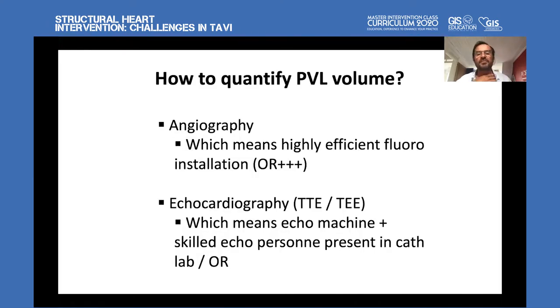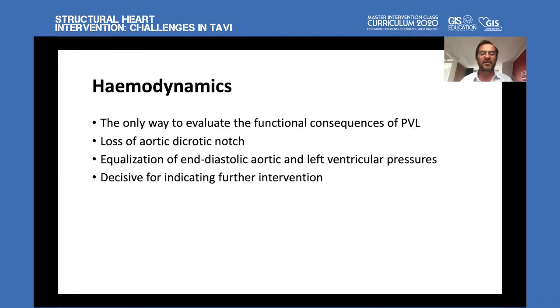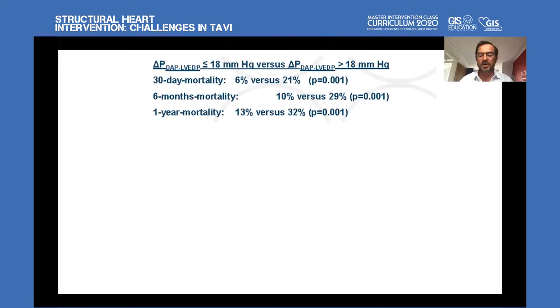So how to quantify PVL volume? I'll go very fast. Angiography, I don't believe, except when it is very strong. Echo, I would not recommend. We do not use TE because TE means a general anesthesia. And TTE is not good enough. Hemodynamics only evaluates the functional consequence of PVL. Equalization of end-diastolic aortic and left ventricular pressure is decisive for indicating further intervention. And I recommend this study from Sinning, extremely important.